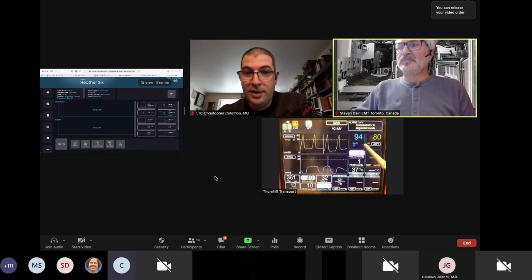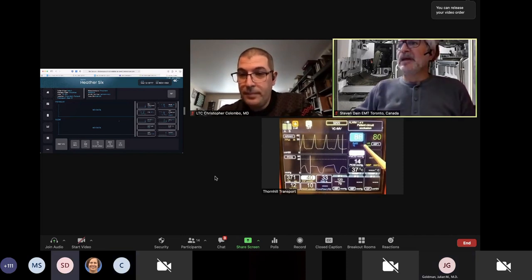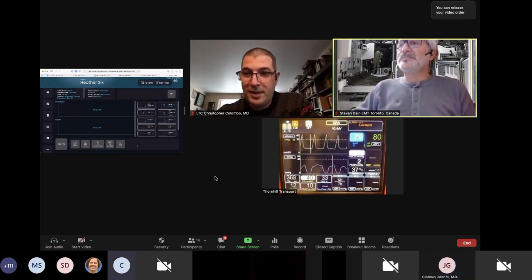We'll watch that SAT. Again, if we need to readjust that probe. I see we're in the 90s now. Is that what you're reading? I'm reading on my app. Yes, I'm getting 91, 89. We're winning. Okay, we had a transient response there. So we will stick with you and continue to make adjustments.